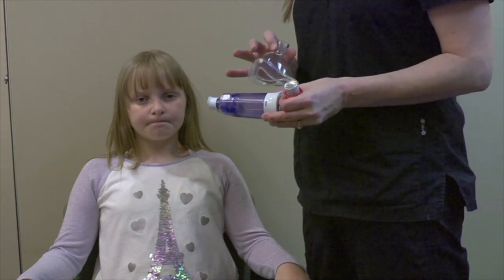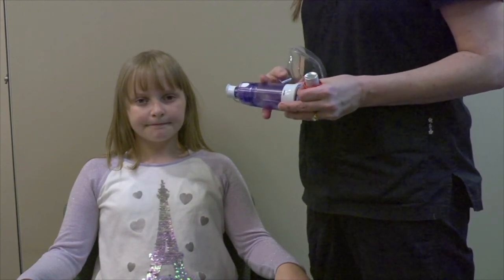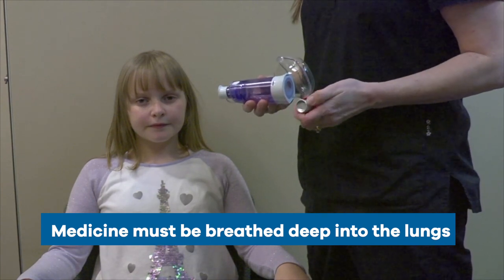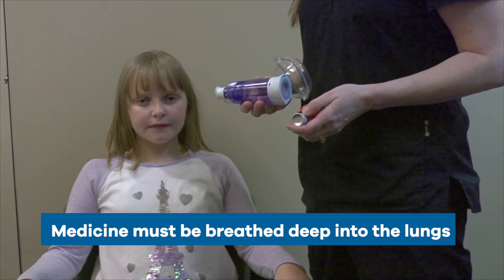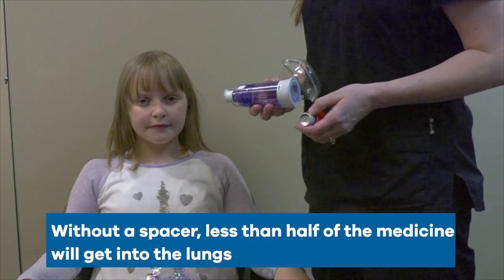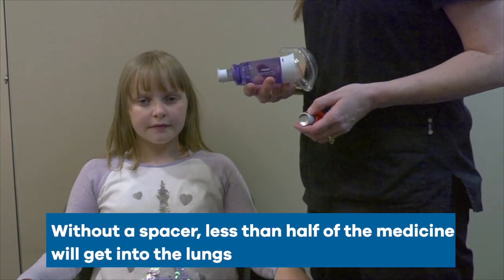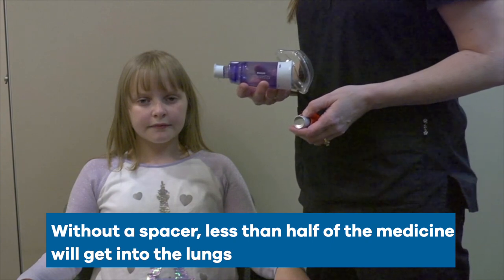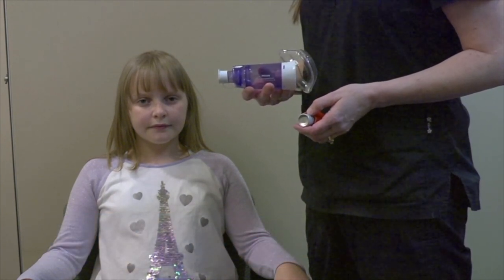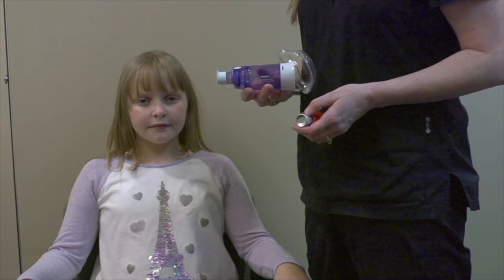The most common way to take asthma medicine is with an inhaler. The medicine from an inhaler is sprayed out and needs to be breathed deep into the lungs. In order to get the medicine all the way into the lungs, you need to use a spacer. If you don't use a spacer, less than half of the medicine will make it into the lungs — most will stick in your mouth and throat.